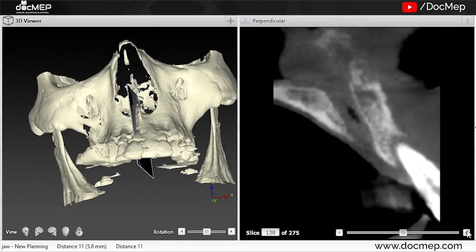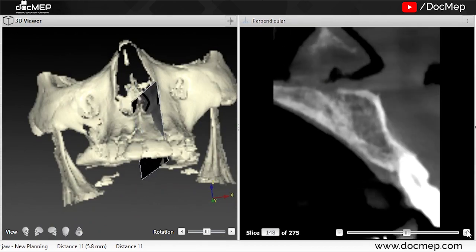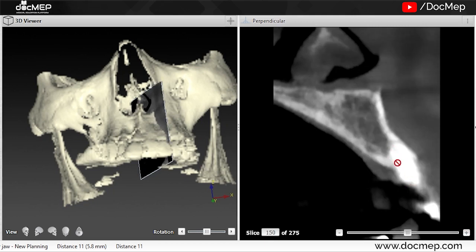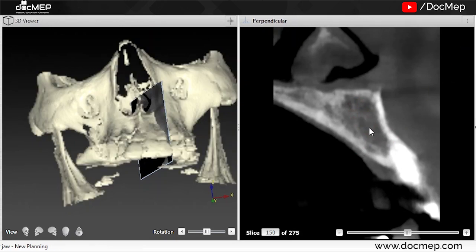Now, as we are going on the left side, this is the lateral incisor coming in and you have a B3 type of bone here. Good cortex, but inside it is hollow. If you check it, this is mixed — plus and minus. So, inside these white areas, they are sufficient to anchor your implant and the osteotomy required will be under-osteotomy.